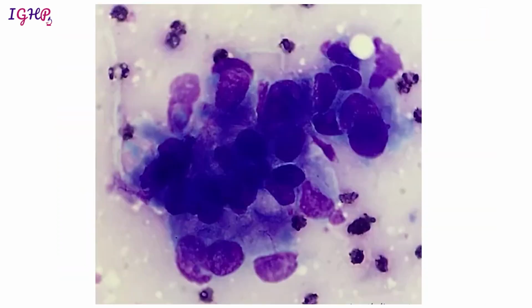Now suppose from the same lesion we get multiple clusters like this. So in this smear we have got multiple clusters which are showing you hyperchromasia, irregular nuclear membranes, there is overlapping, and there are many clusters like this on the smear. So we have no problem in calling it as malignant. It is not looking like a neuroendocrine tumor, there are no neuroendocrine features, and it is definitely looking malignant. So we are going to call it as a category 6 lesion, that is malignancy, and it is an adenocarcinoma. So that was about the different categories that we will see for the pancreatic lesion.